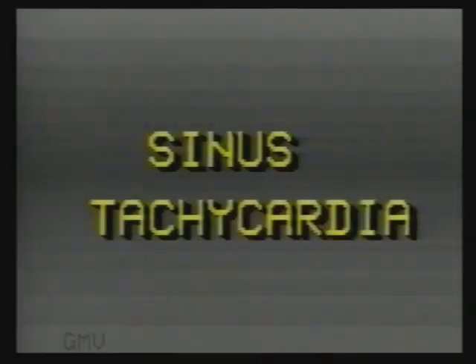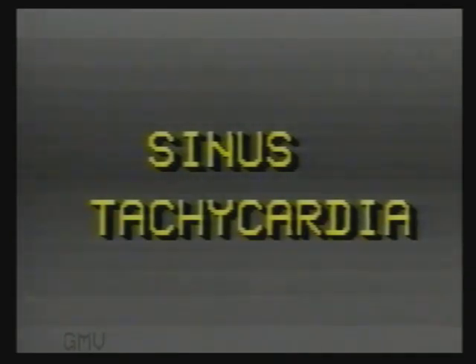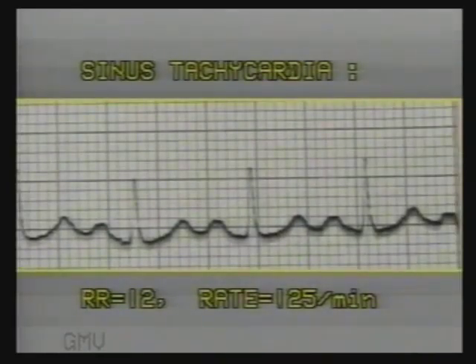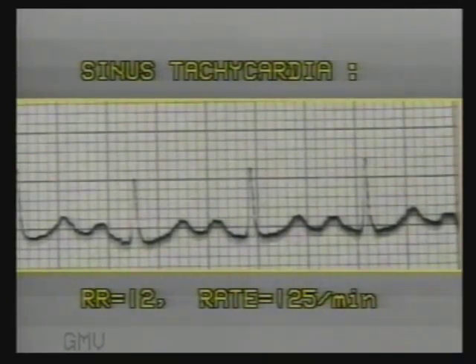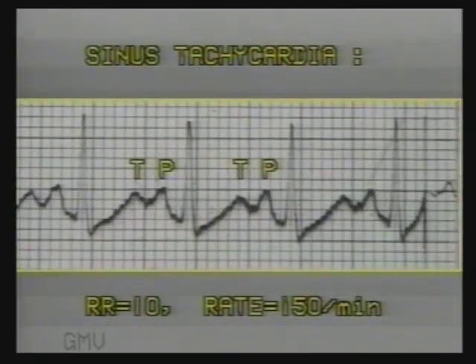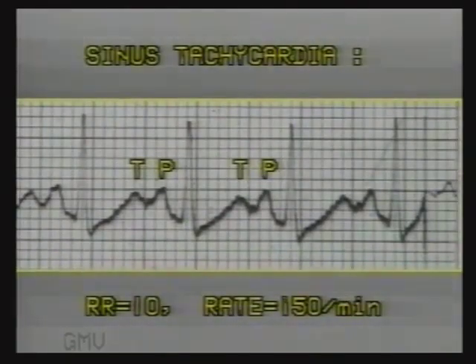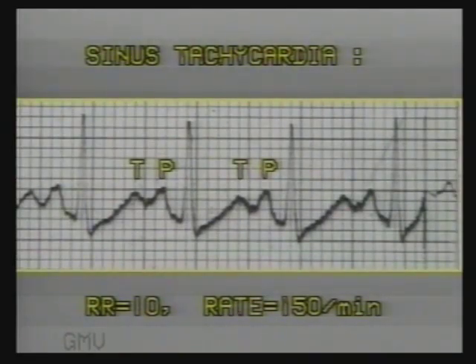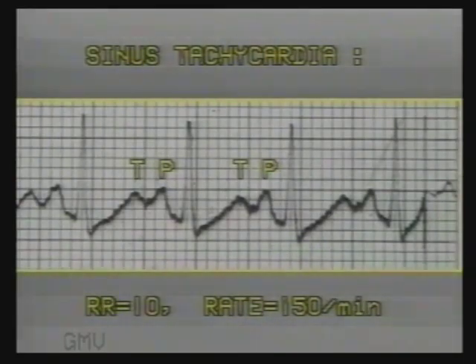Sinus tachycardia: if the sinus rate is above 100 per minute and up to 150 per minute, it is termed as sinus tachycardia. In this ECG, the RR interval is 12 millimetres, so the heart rate is 125 per minute. The T wave and the next P wave are seen very close together. At high rates, the P waves and the previous T waves mix up and P waves become difficult to identify. In this ECG, the RR interval is 10 millimetres, so the heart rate is 150 per minute.